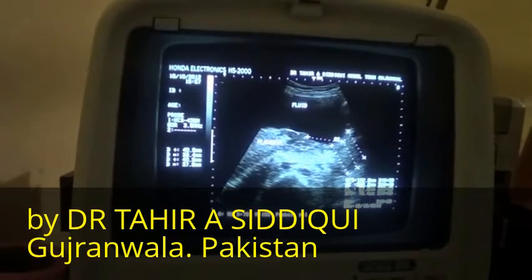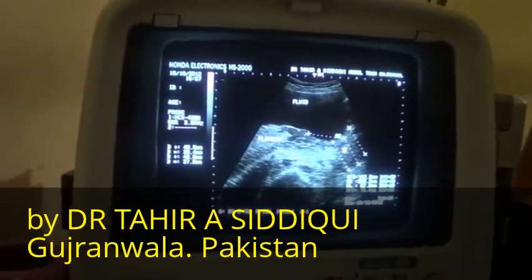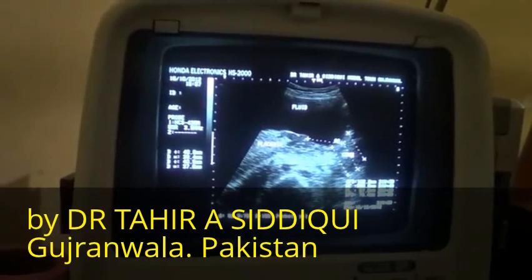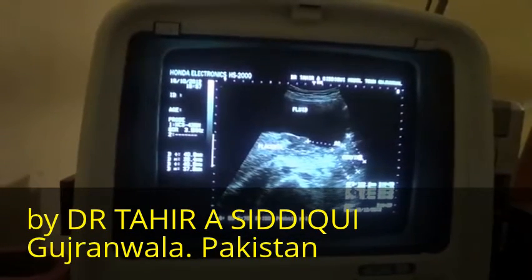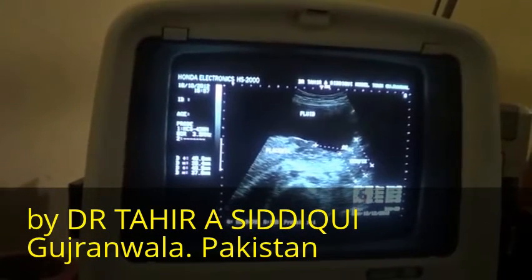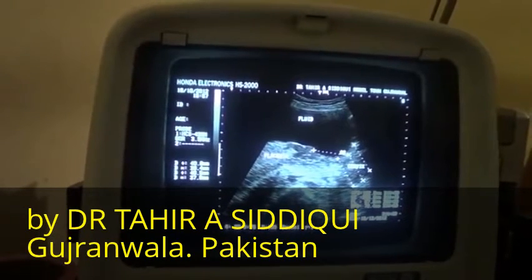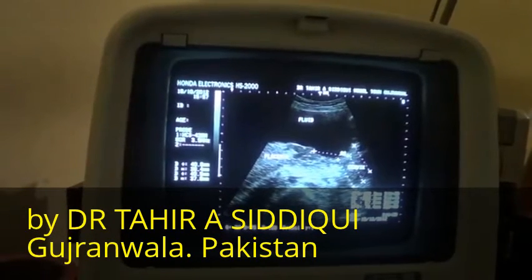The minimum acceptable cervix length is 25 millimeters.